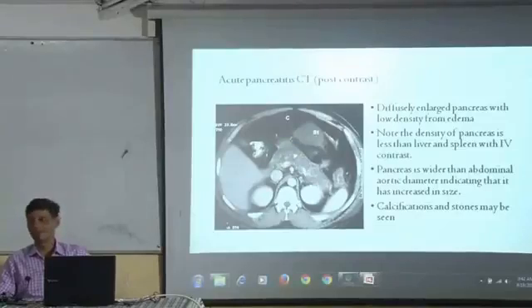I can show you a CT of a child and then tell you that he has presented to you with acute pancreatitis. What is the most likely reason for it? The most common cause of acute pancreatitis in young children is abdominal trauma. Okay? And then one word is used, idiopathic pancreatitis. Technically the word, what happened you ask me, I'll tell you.